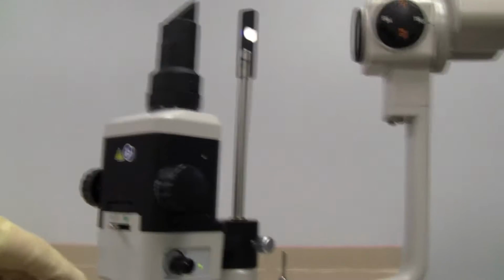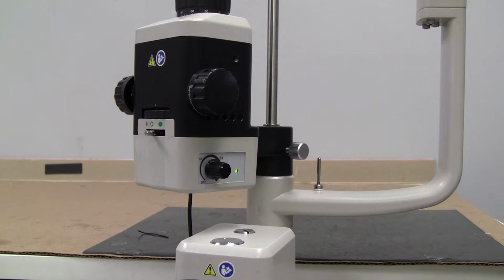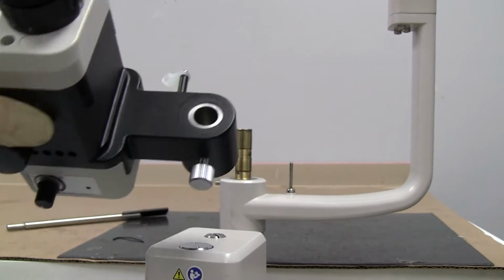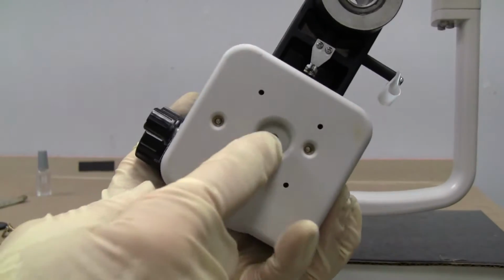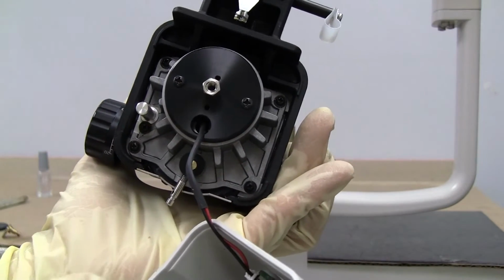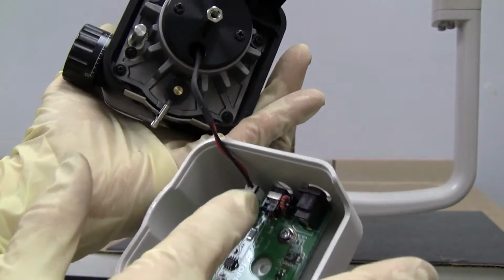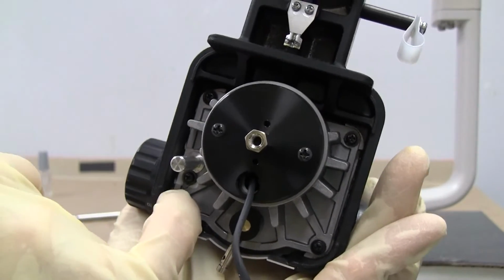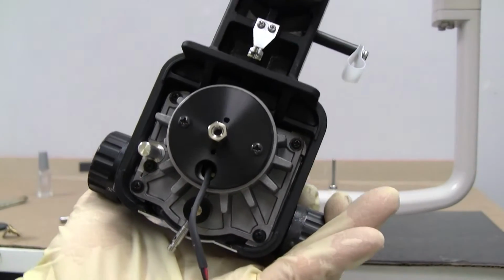So underneath here, we're going to take this apart to get to it. Okay, we took the little E-ring off the top, E-clip, C-clip. There's an Allen screw under here. Take that off. Because this is a 2G, it's LED, so we need to take this apart. Take this cable off. And then we've got to remove 4 screws, 4 Phillips in the 4 corners to take that assembly out.